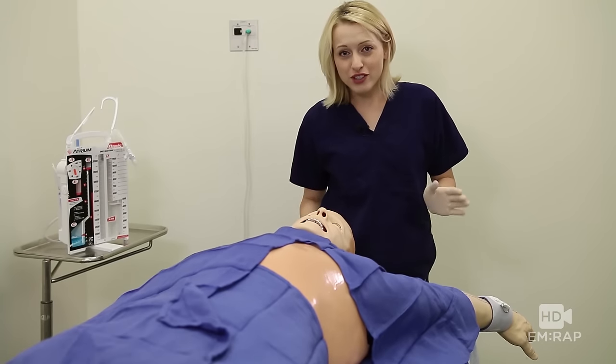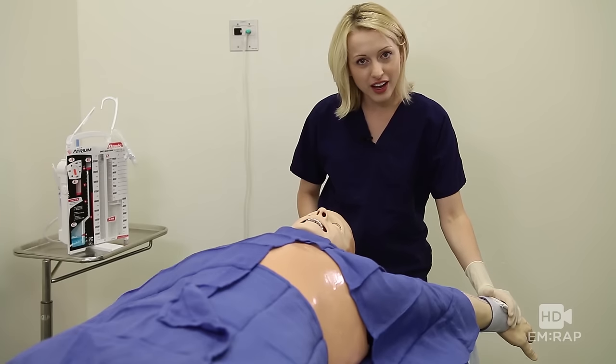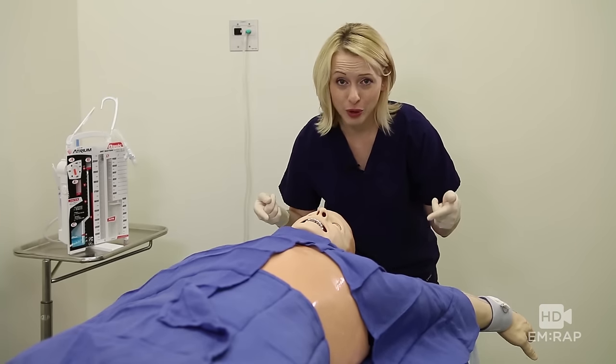Before you get started, make sure your patient's pain is well controlled and secure their arm up behind their head with tape or restraint. You want to make sure this guy doesn't move.